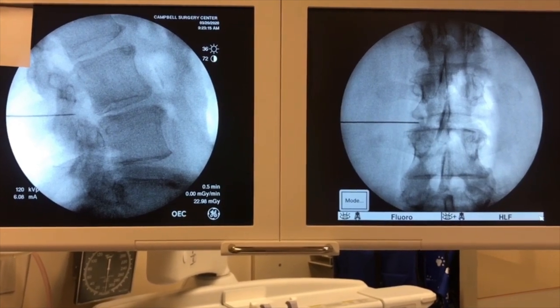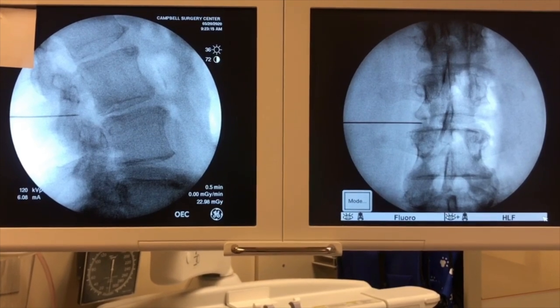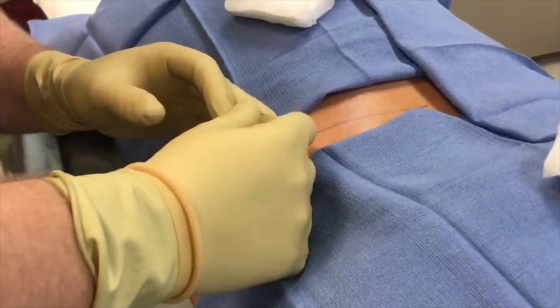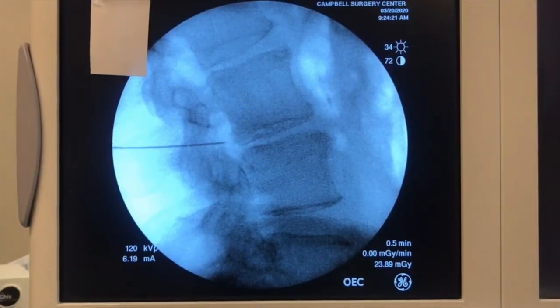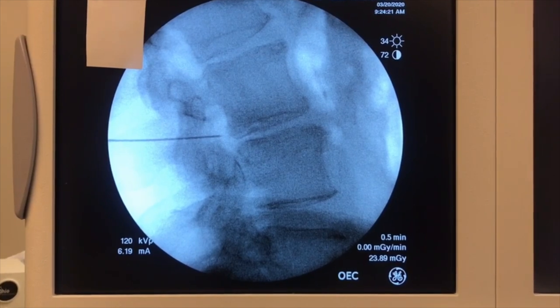We're not quite into the foramen yet — the tip is in the facet joint capsule, skiving off bone. With the bevel pointed downward to skive: if you turn the bevel posteriorly it digs into the facet, but with it going downward it'll skive you ventral to the facet. I advance the needle a little more with two hands, very gently, and feel a little pop — that pop is going through the facet joint capsule. Under the lateral view I'm now ventral to the superior articular process of L4, in the foramen.